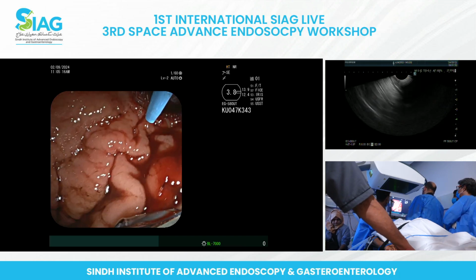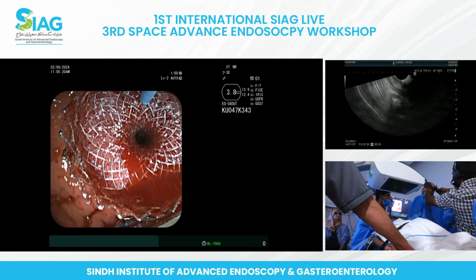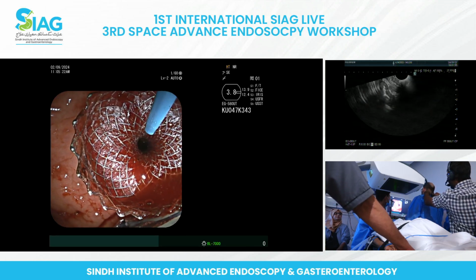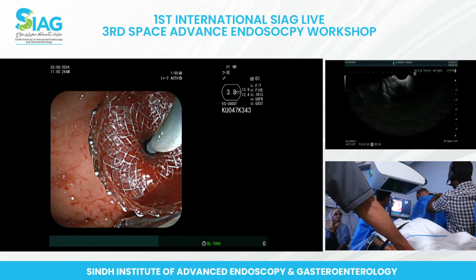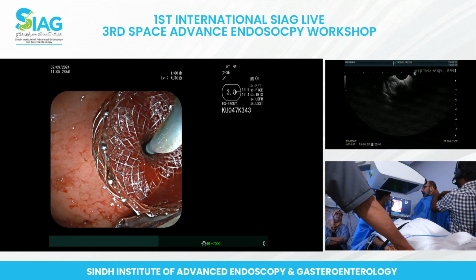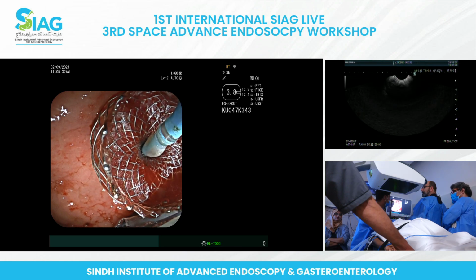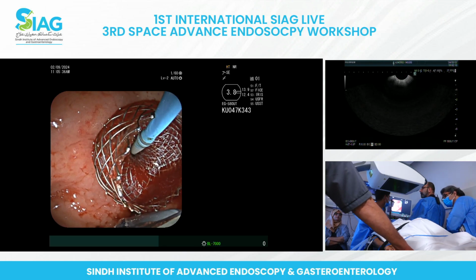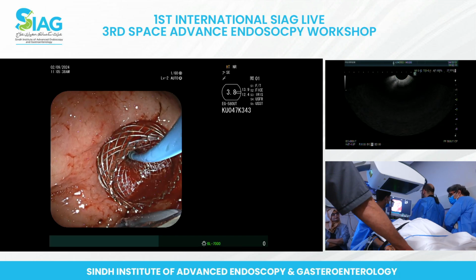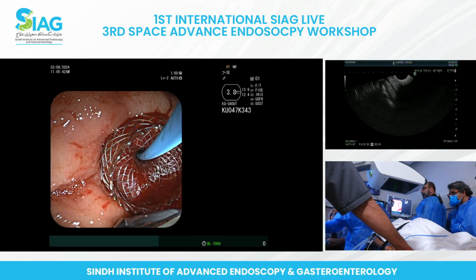Khalid, we can't hear. Hello? Take a contrast in. You put the contrast already? We did earlier. Hello? Yes, can you hear me? Yeah, we can hear you. Not very loud, but we can hear you. Okay. We're just making sure we're in the right place. So we're going to put the wire down and inject contrast. Can we see the fluoroscopy, please?